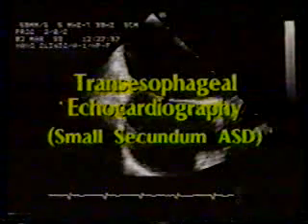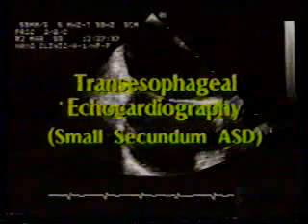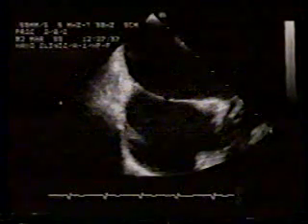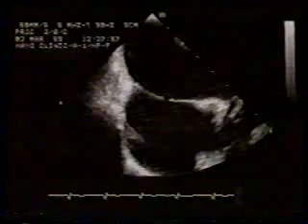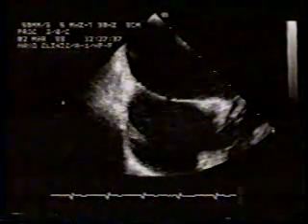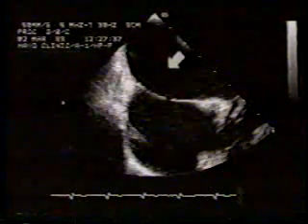Now we will demonstrate the utility of transesophageal echocardiography in visualization of ASDs in 2 patients in whom standard 2D echo examination failed to visualize the defect. This is the still frame of a 20-year-old patient undergoing transesophageal echocardiography.